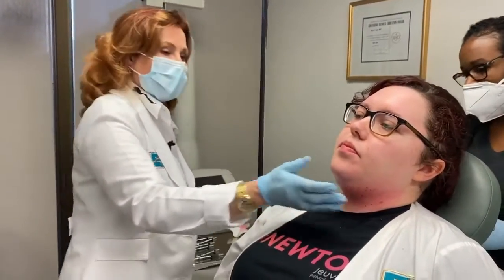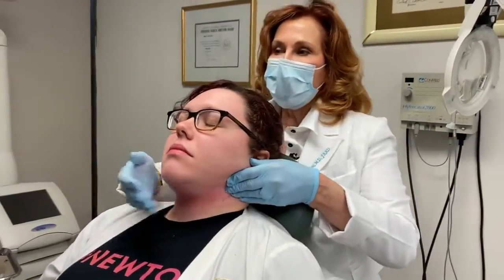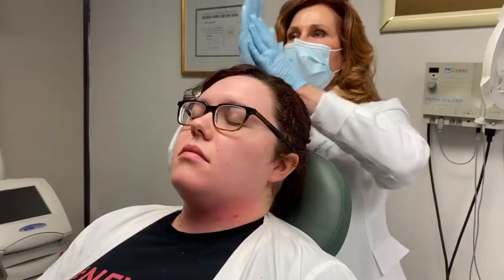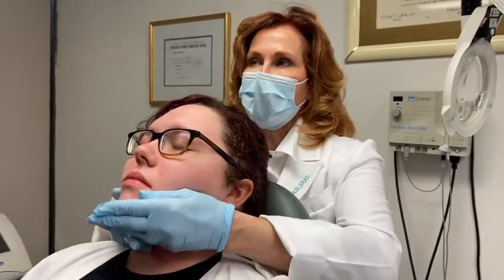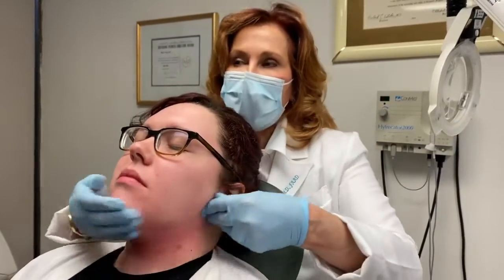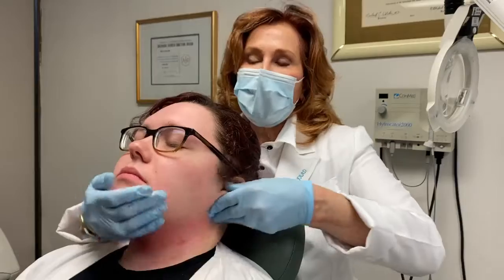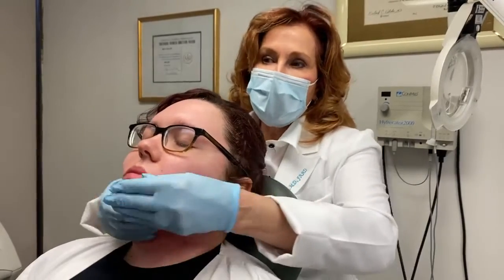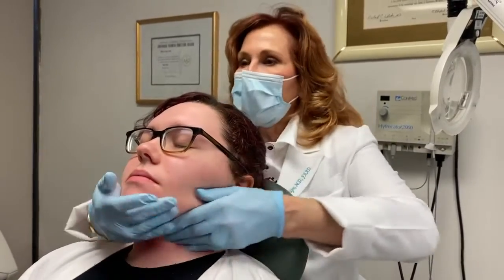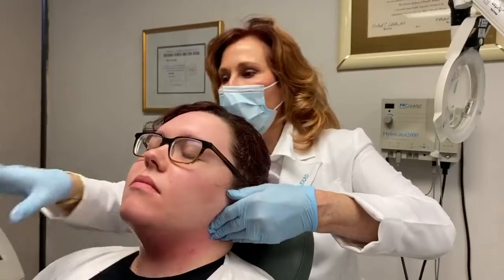The final thing I do when I'm done is a manual massage. I use an anti-bruise gel, but the purpose is to stimulate the lymphatics, which drain the fat. Remember that deoxycholic acid works by lysing the lipocytes — it emulsifies the fat and the cells actually rupture, so the fat reduction is permanent. The lymphatics drain the fat away, and they're on the side of the neck, so I do this massage. I also tell the patient to do this massage at home as well — I think it helps.